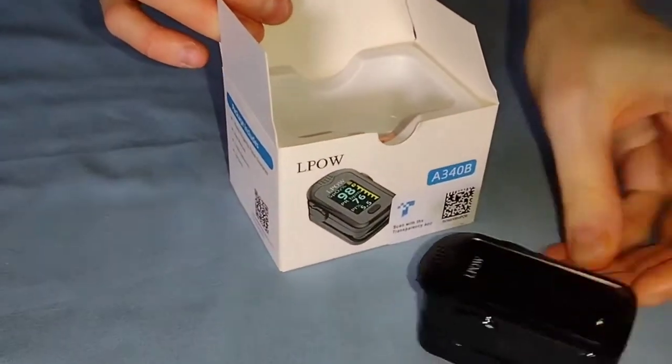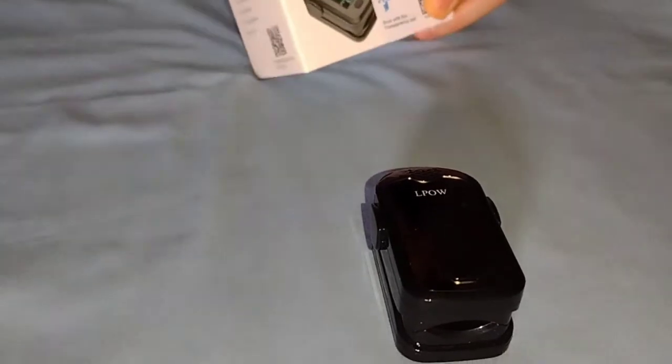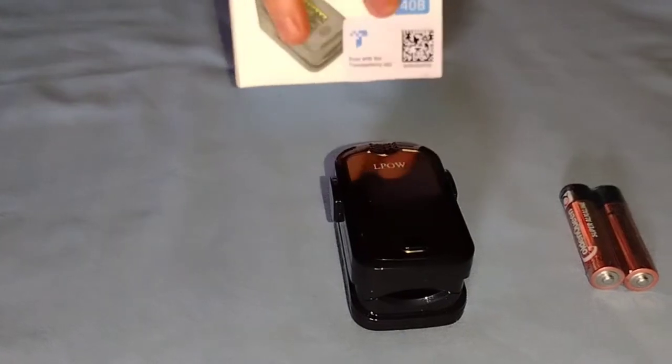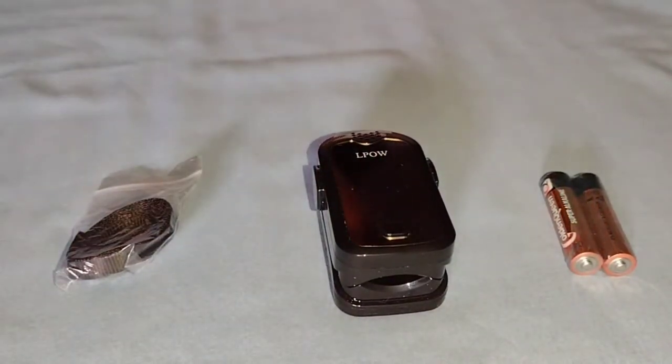This is the oximeter itself — it is lightweight and portable. Also included in the box are two batteries to power it on, and a black lanyard which is handy for hanging it up, wearing it around your neck, or hanging it from a bed post.